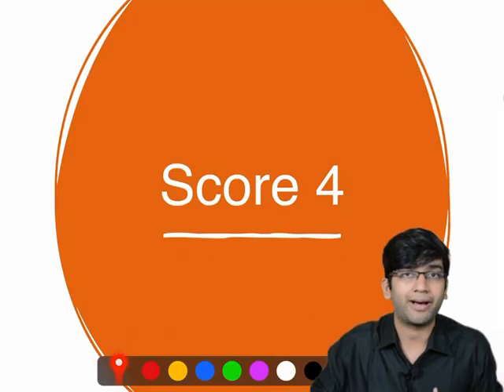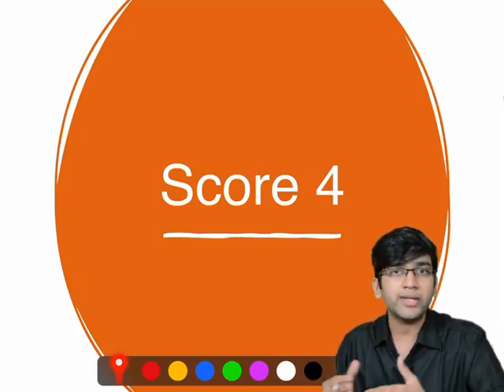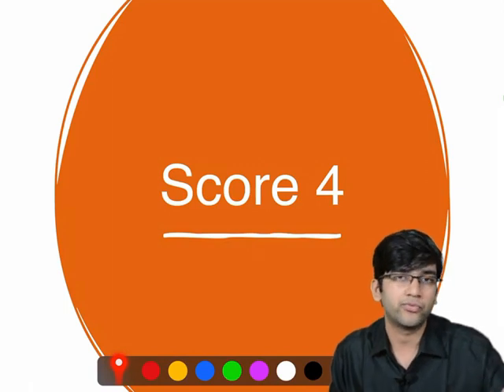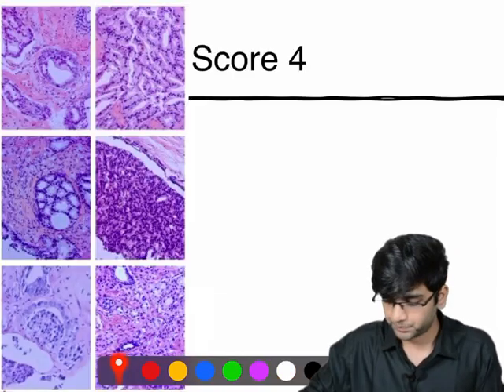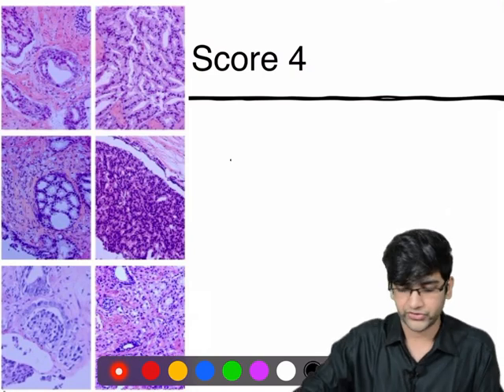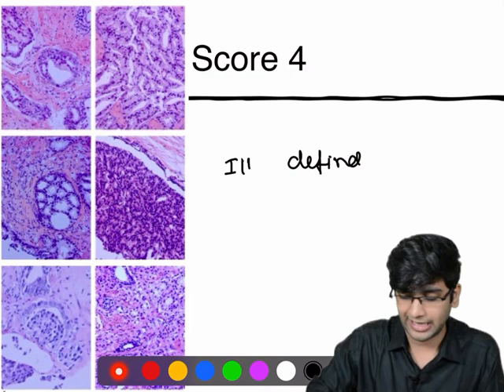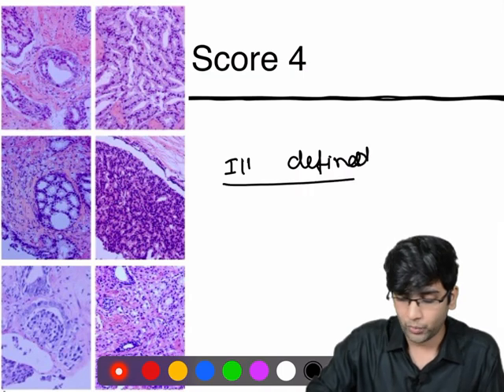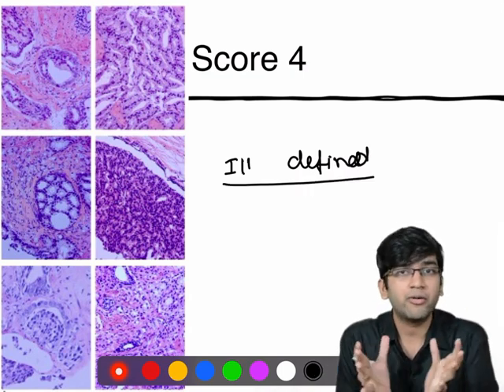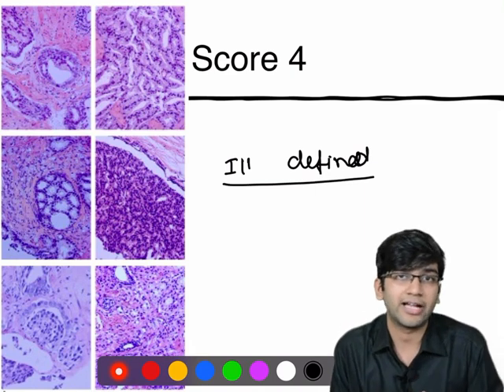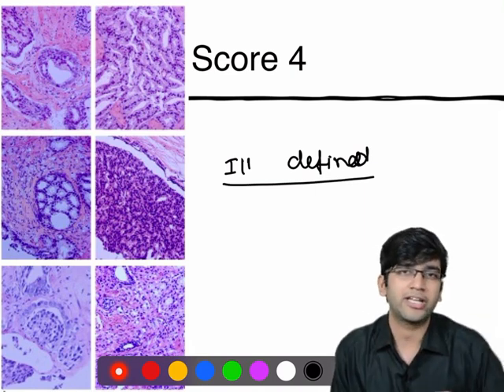Now moving to the score four pattern. When I look at microscopy and see the following features, I am going to give a score of four. First thing: an ill-defined gland. I call it an ill-defined gland when the lumen is not perfect — when I don't have a perfect lumen, or when it is very narrow and very constricted. I am going to call it an ill-defined gland.